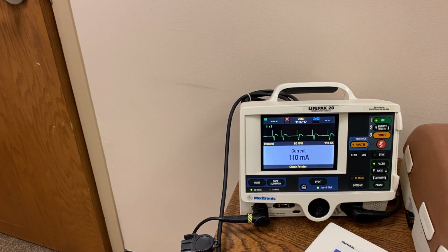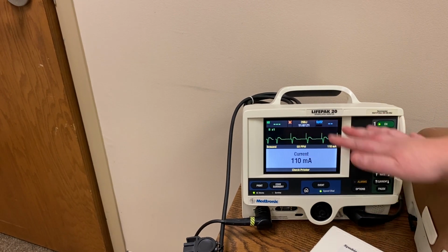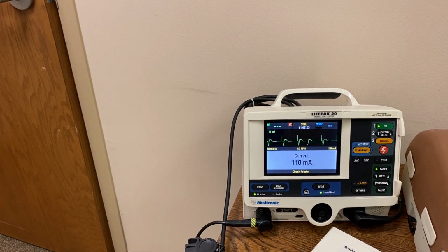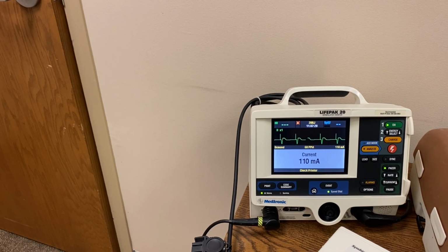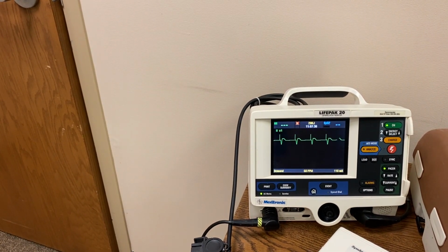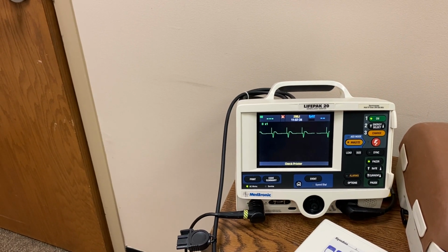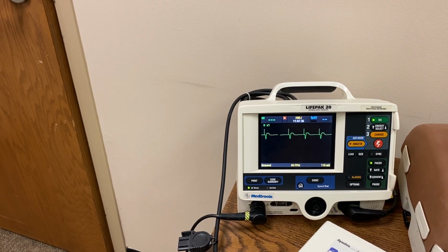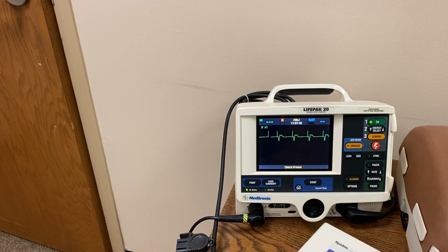So if for some reason you're not able to get a good pacer spike, wide QRS, not good capture, maybe you need to readjust the leads, make sure that they're adhering well to the skin. And always, if you lose a pulse, CPR. Okay, those are the things that you need to remember when you're doing emergent pacing.